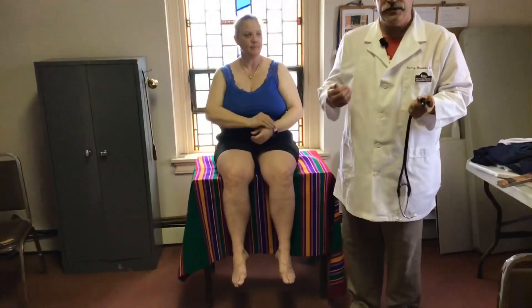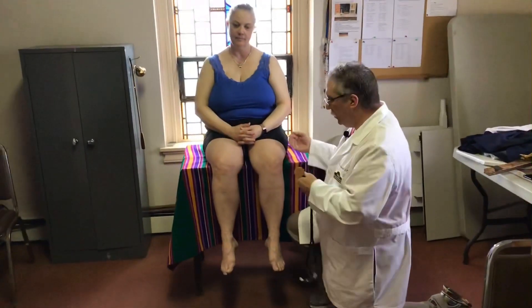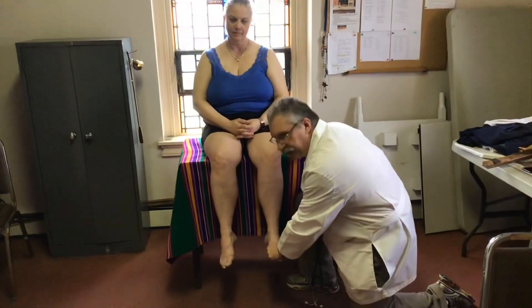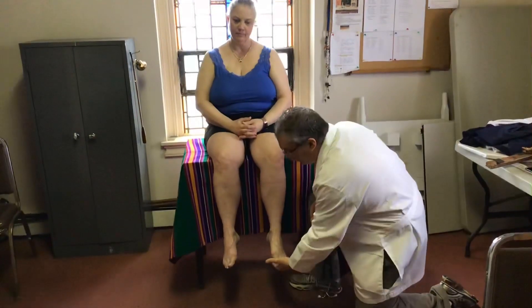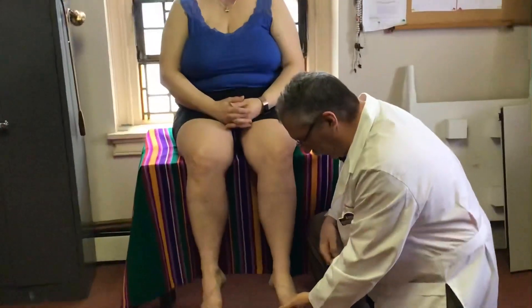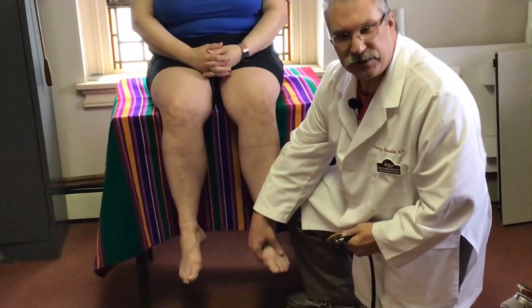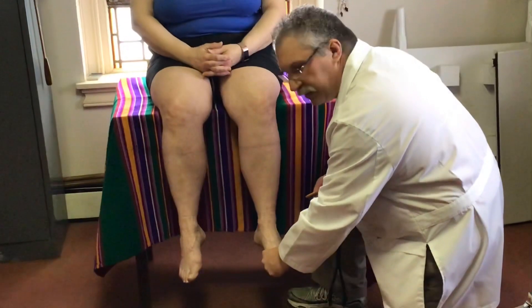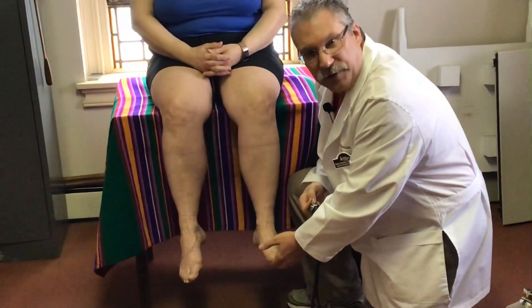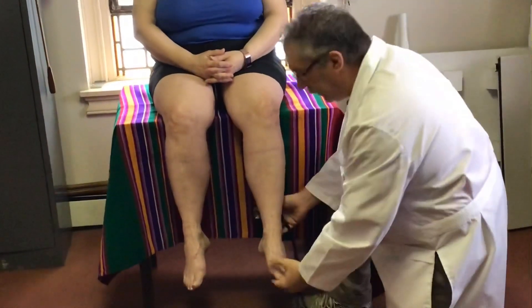The last one is the Achilles tendon reflex. The patient should be totally, totally relaxed. You're not going to grab the foot because then you won't be able to solicit the response. Instead, just gently and very lightly hold the forefoot on the bottom. Once you get the response, the foot is going to push against you — it'll be a subtle movement, just pushing your hand away a little bit. If you hold it tight or push too far up, you'll never get that response. The Achilles is another huge tendon that runs up the back of the leg from the heel.